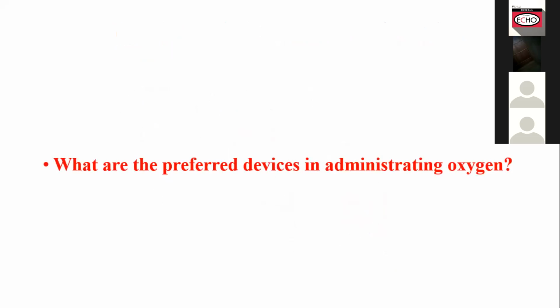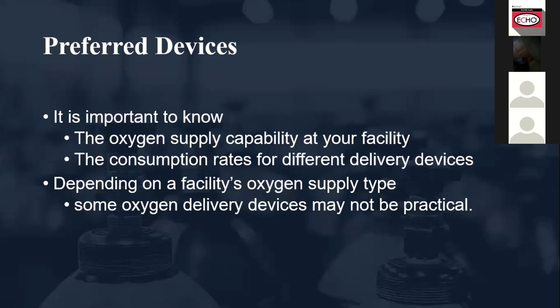Okay, so the question is, what are the preferred devices in administering oxygen? I think here everyone can answer this question. So next, to see the answer.